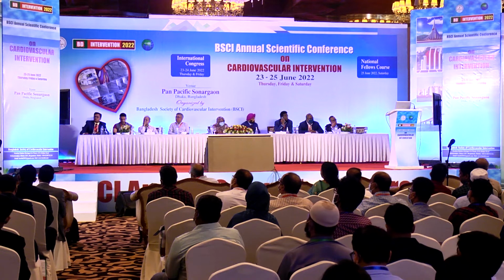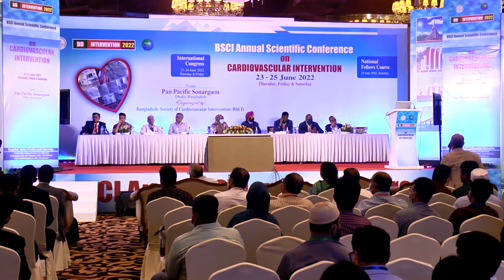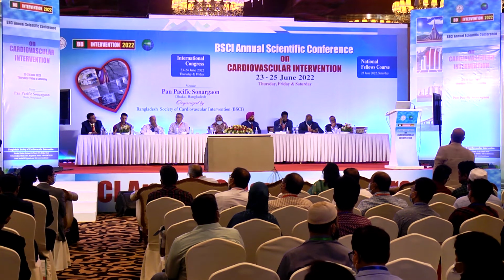You want to see the side branch? Sanjog, in that particular situation, do you consider OCT or IVUS? Because you know, pre-assessment is done by IVUS, so I think IVUS is the best option for the post-assessment. I would stick with it. There's no reason to say that you can't do OCT in the left main. That's a myth. But you have an IVUS open, and you'll get all of the information that you need. So yes, use the IVUS.